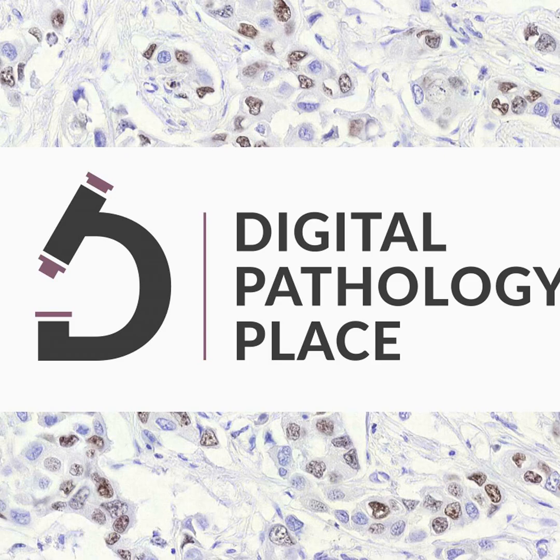And domain shift would be, we want to apply a solution from one domain to a different domain that is similar, right? Similar meaning we are still working on H&E stained whole slide images. Right. But different in that, different scanner, different lab, anything like that. So it's some sort of target domain that's different from the source.